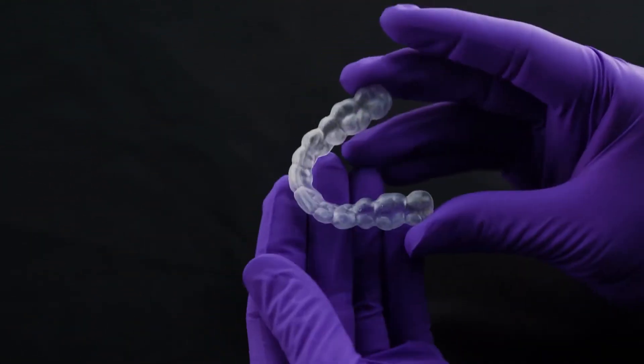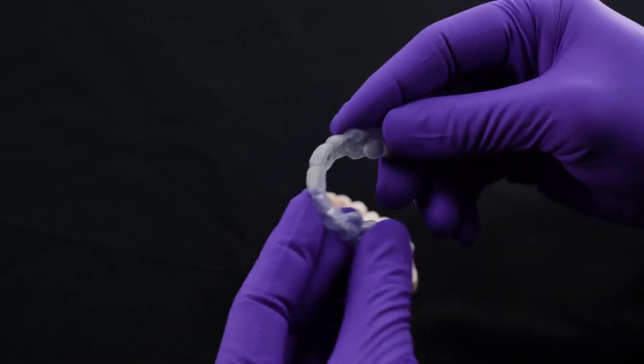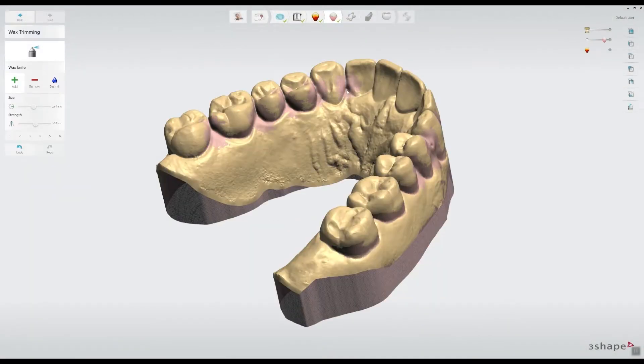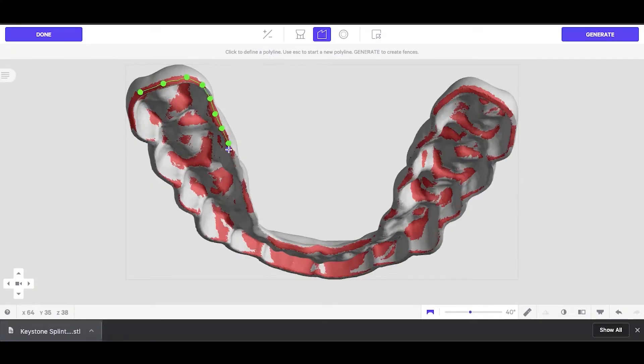With a streamlined and simplified digital workflow, Keysplint 3D night guards are one of the most common applications for our Carbon 3D printer. Capable of being built with traditional analog models or full arch intraoral scans, the retainers are computer designed and computer processed. Once the design is set, the files are simply transmitted to the printer before being cured and polished.